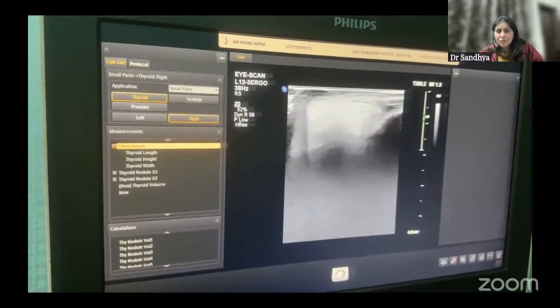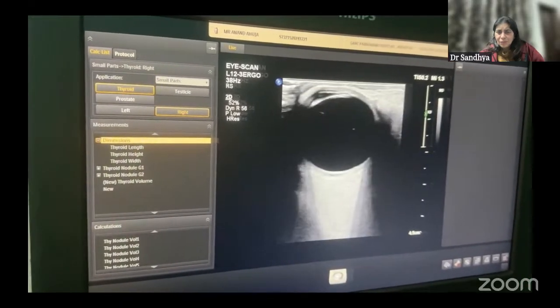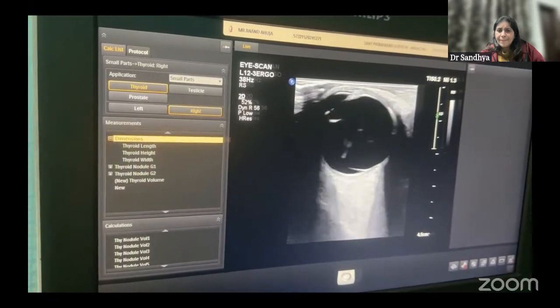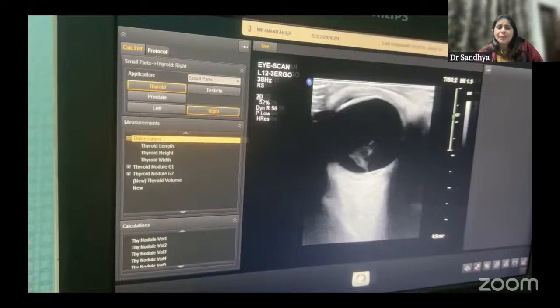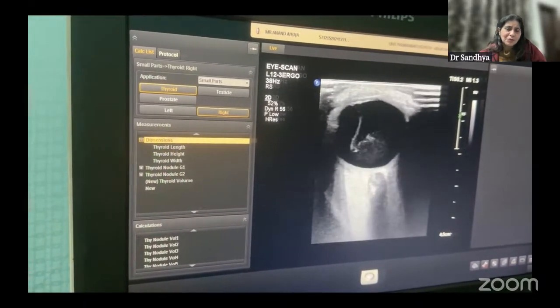So now we tell the patient to move the eyes right and left. So this is a kinetic sonography, when we ask the patient to move the eyes and we look for movements of the membranes and after-movements.